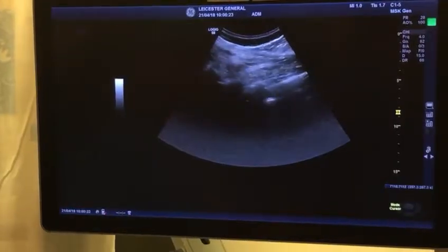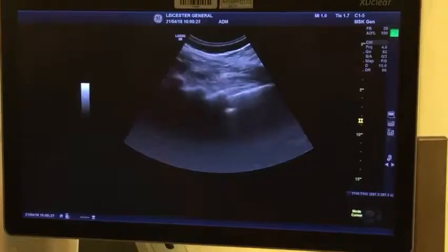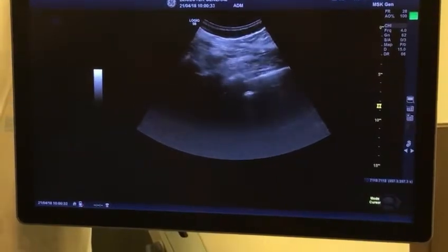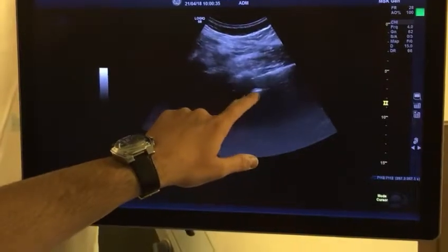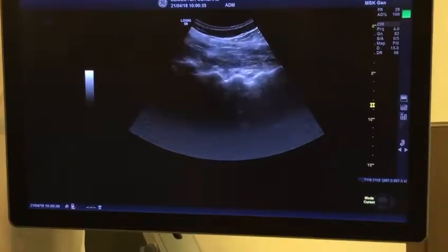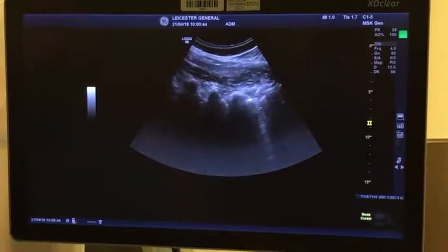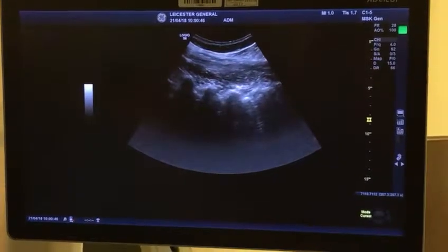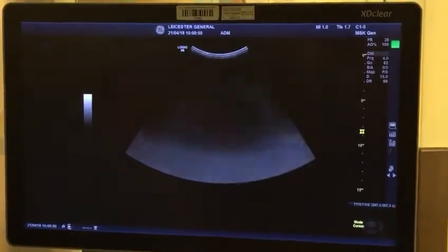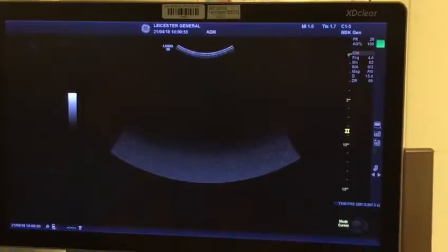Keep going more medially, then you should start to see the intrathecal space at some point. Get more gel, and that's basically that. You can see the dura. That's the interlaminar view. So interlaminar view, articular process view, and you move laterally, and that's your transverse process view. So basically that's what you look for. That's your lumbar spine done. I'll show you the sacroiliac joint, and then that's the spine bit done.